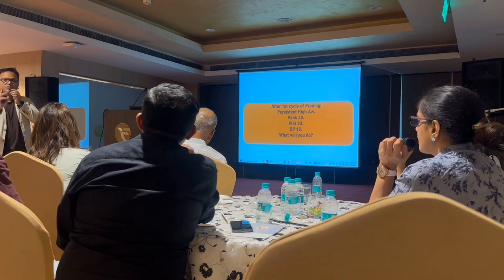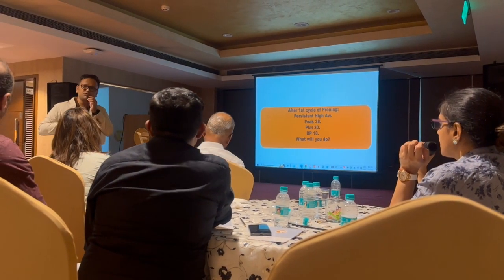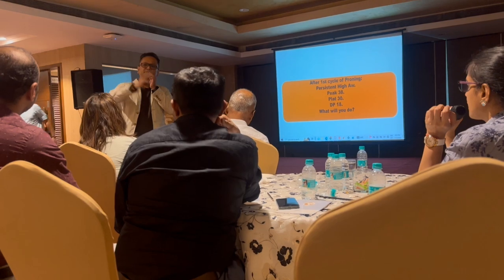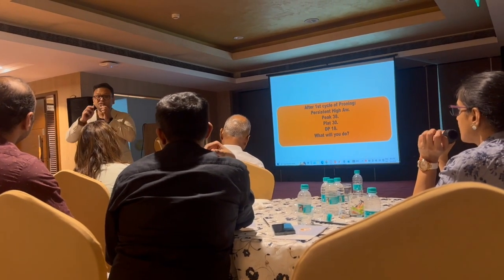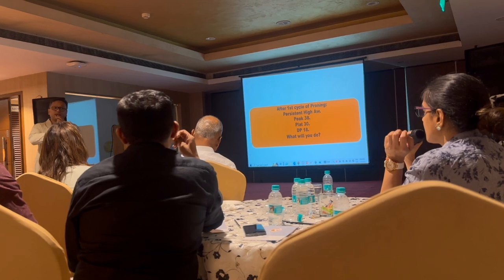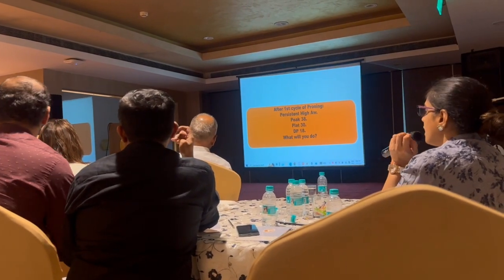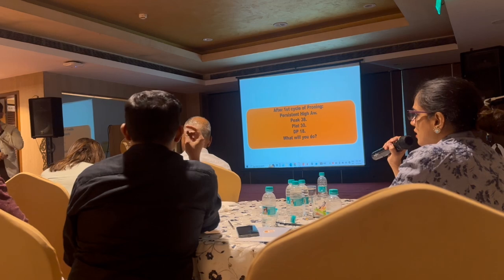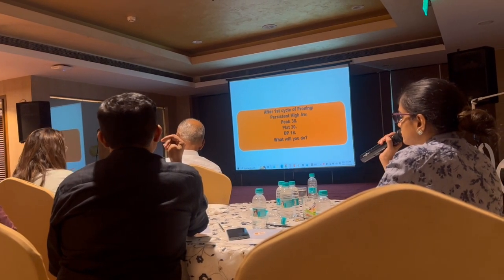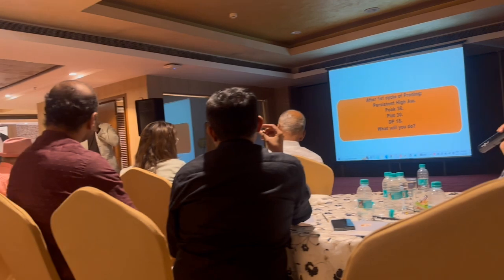See, proning means your patient should change in terms of the recruitment of the lung. There is some improvement which has happened, but not the complete resolution. Still the driving pressure is beyond 14, which means the patient is still having ongoing ventilator-induced lung injury. What do you think, Dr. Sharma? If we can reduce the tidal volume further. That's very good. So you can further consider reducing, provided that hypoxemia is not worsening and hypercarbia is acceptable.